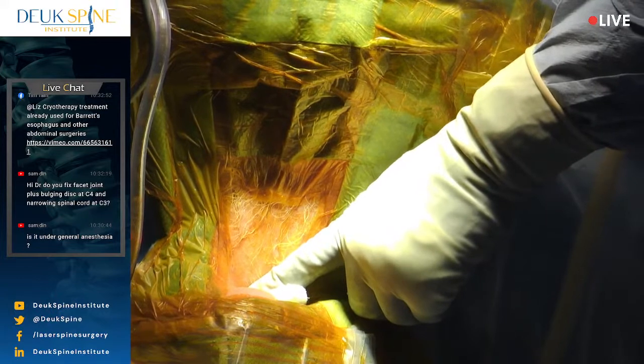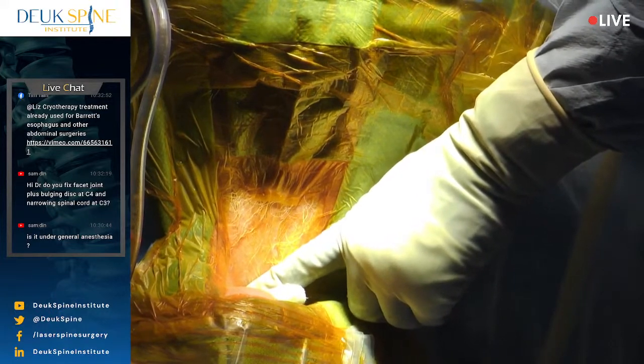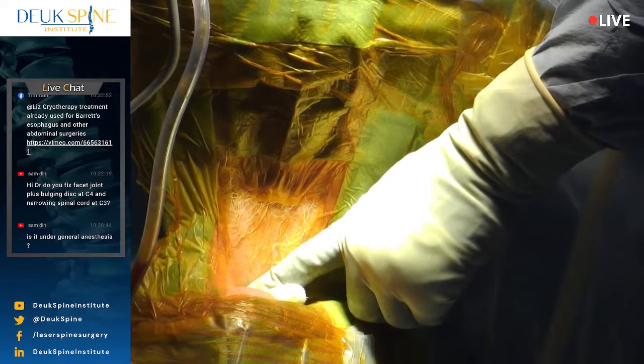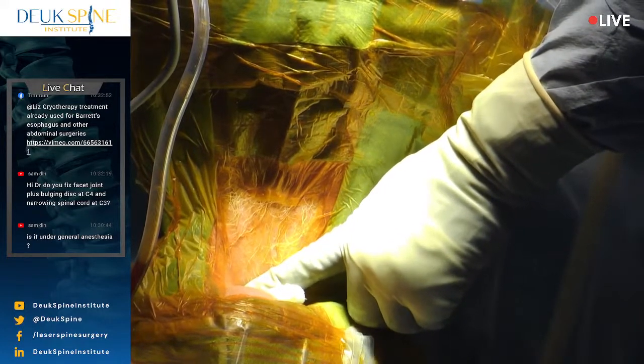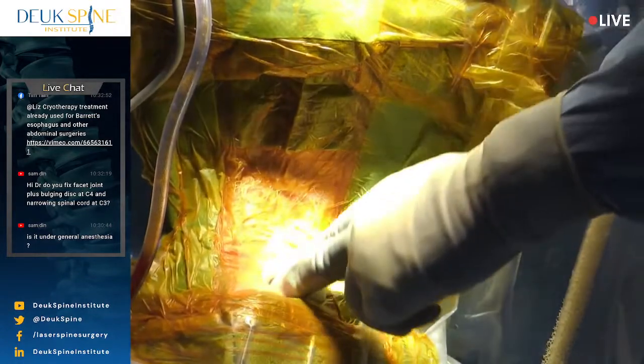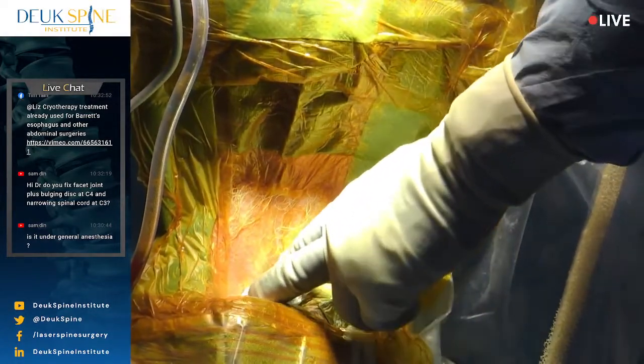All right, I like to hold pressure for a few minutes. It's just venous ooze. I don't think this guy has any clotting problems, right? He's not on blood thinners. He's not on anti-inflammatories. No ginkgo biloba, fish oil, turmeric. So, what's the problem? No problem.